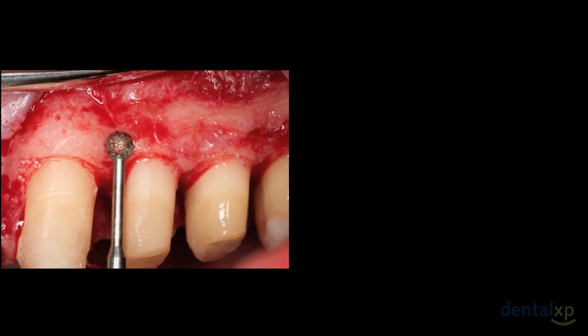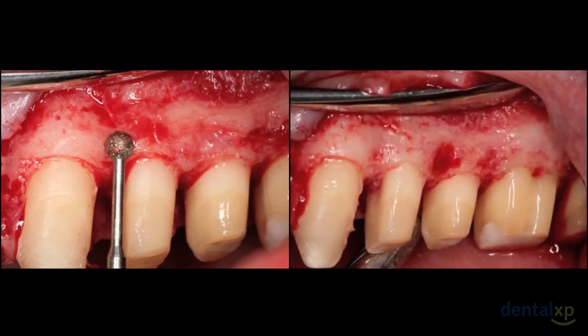Here I am taking again the number 8 diamond round burr, which is the C801L, and gently smoothing the bone, removing any areas where my burr at the interface, using the straight burrs, may have caused little changes to the bone, but this would be normal to create an ideal interface. I'm also removing the exostosis, which you can clearly see in this picture.